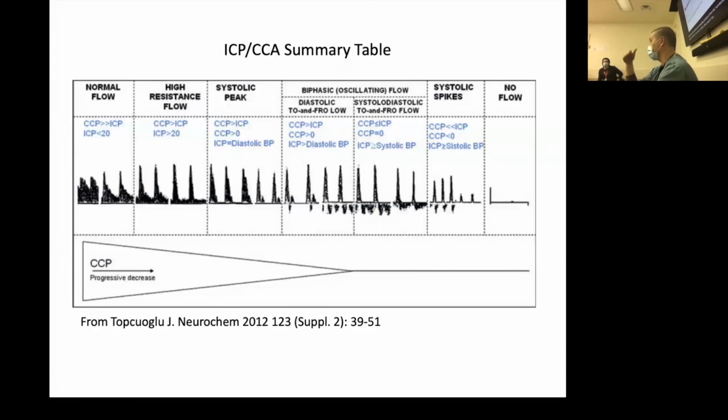And when you're looking at cerebral autoregulation, acute ischemic stroke, or thrombolysis in the context of acute ischemic stroke, you need tons of them. And then you're not even talking about the carotid vessels, which are part of that examination. So it's kind of long-winded, but a few hundred, I would say.